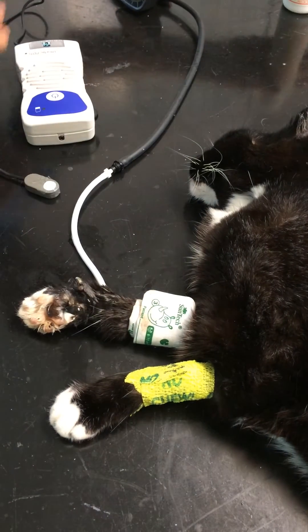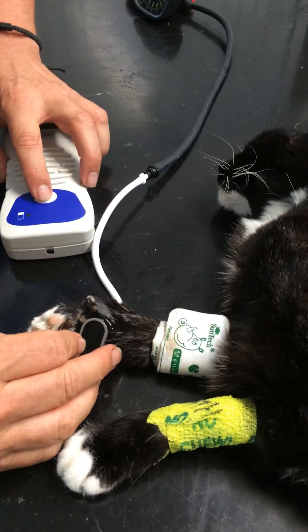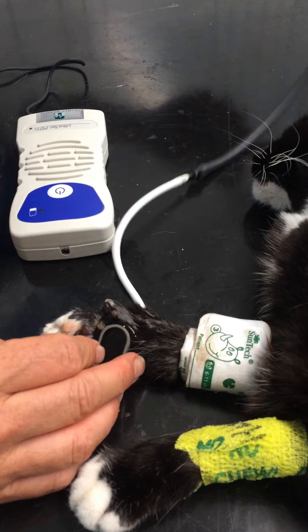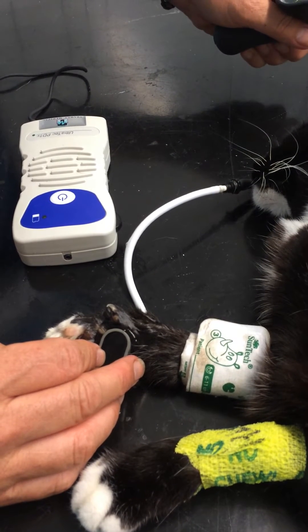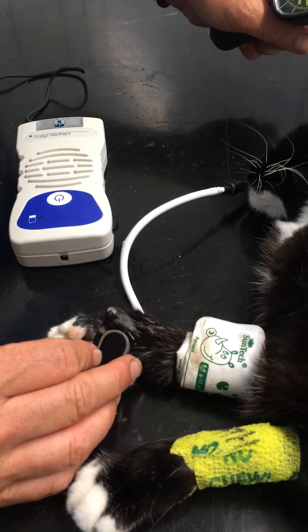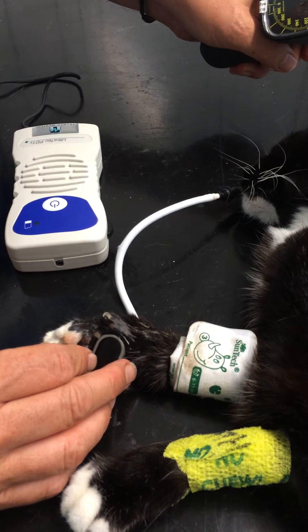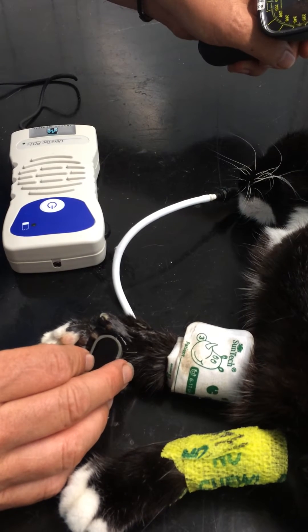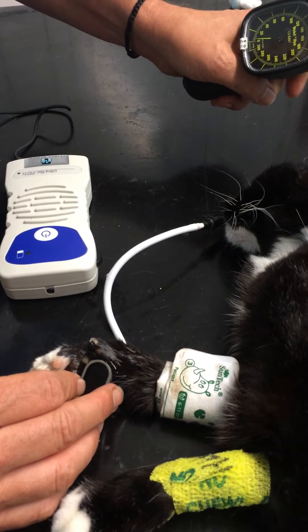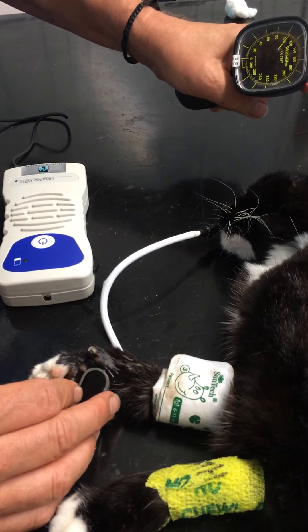We know where the pulse is going to be, so we'll apply the probe, squeeze the cuff up until the pulse disappears, and then smoothly and steadily release the pressure.